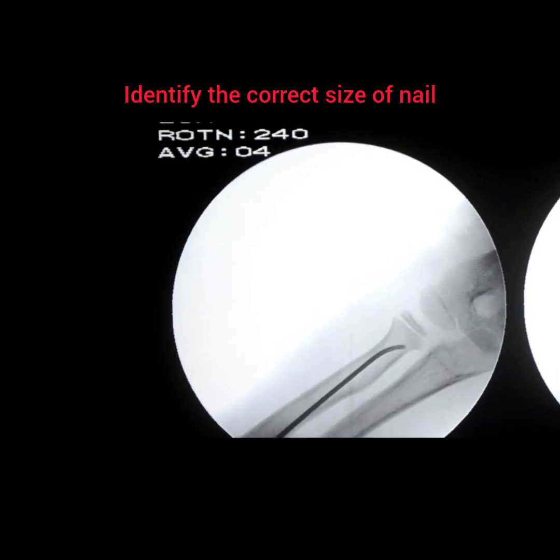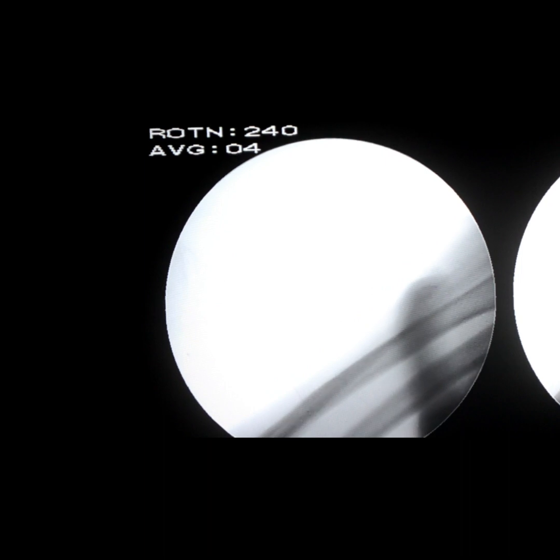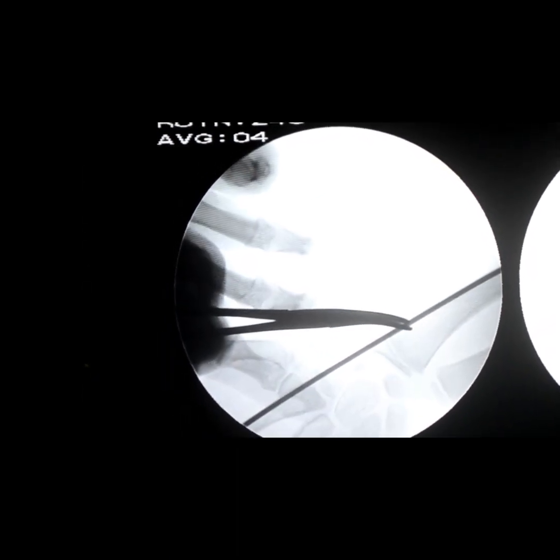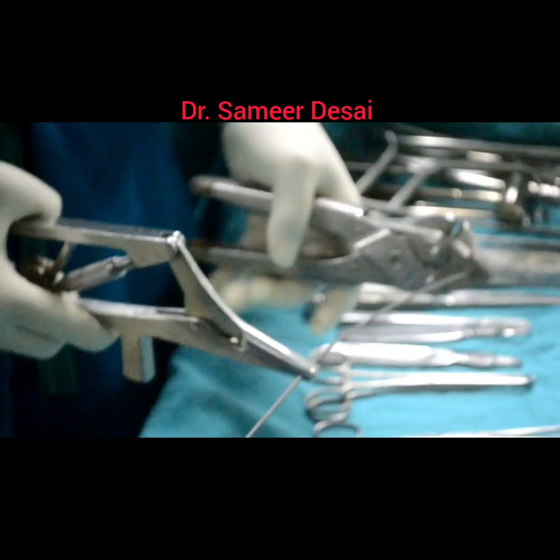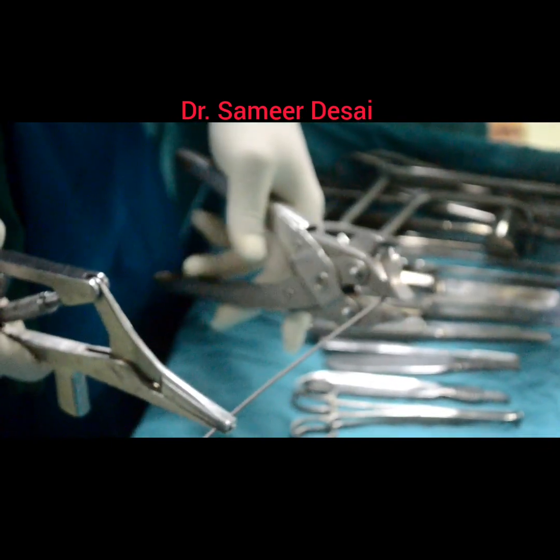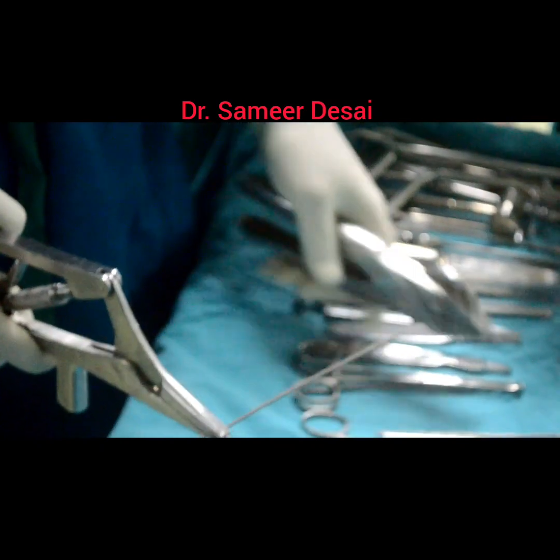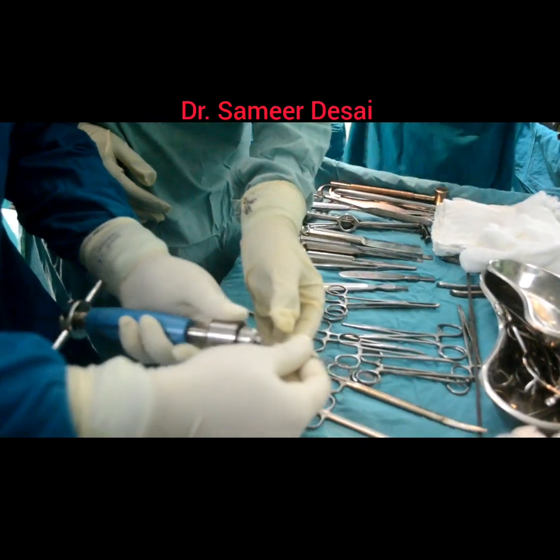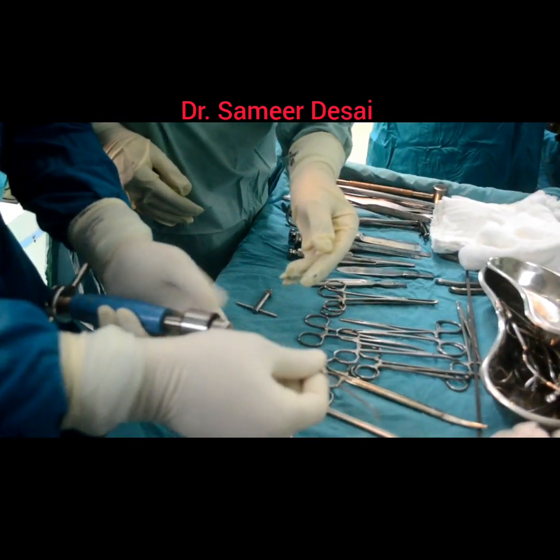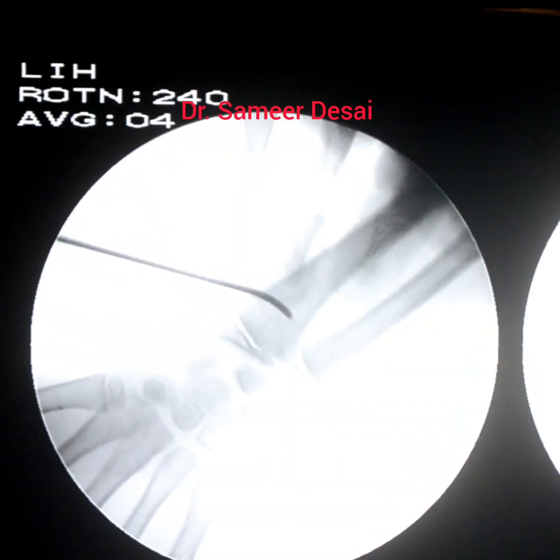Identify the nail size, which should be about 60-70% of the minimum diameter of the radius. Re-bend the nail. Fix the nail to the T-handle in such a way that the tip of the nail should coincide with the horizontal bar of the T-handle.